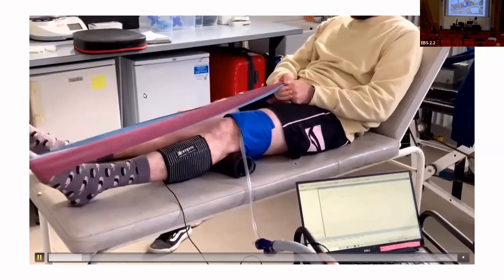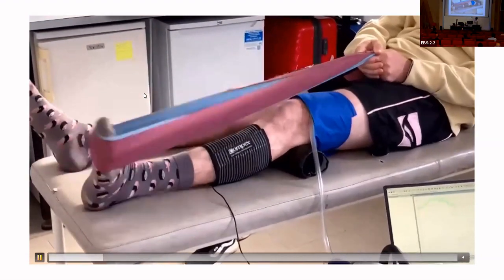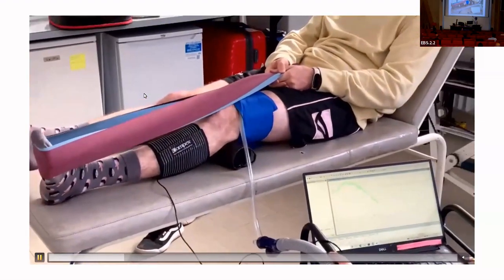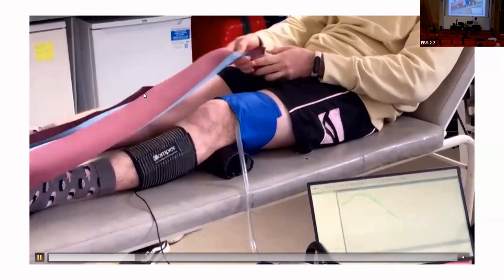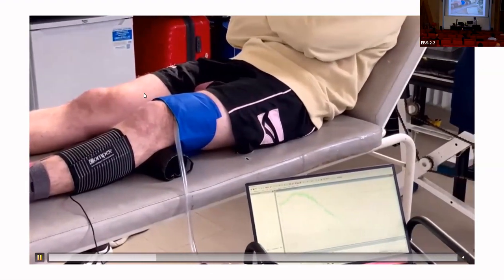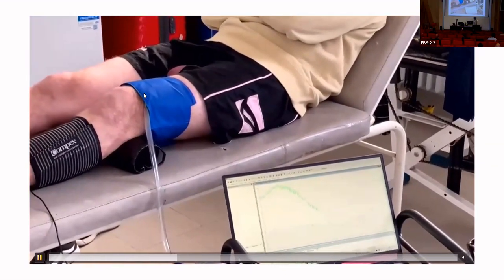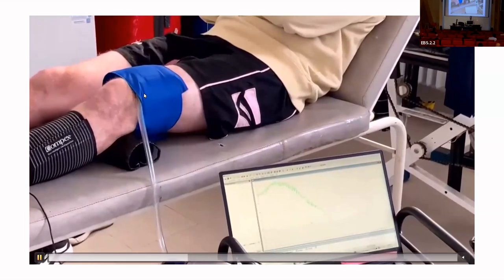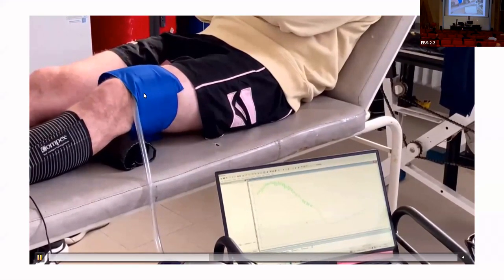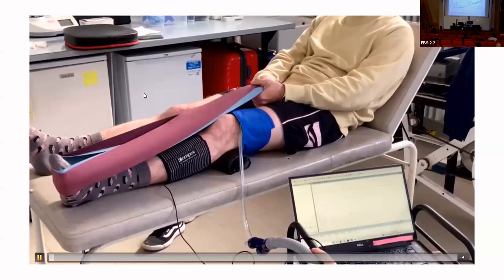So we usually ask the subject to perform an exercise. The near-infrared device is on the gastrocnemius, and here you have the pressure cuff that can be pumped up at different times. Unluckily it's not really easy to see, but you can measure the changes in the TSI signal during the cuff occlusion, and by that calculate the muscle oxygen consumption over time, so in the recovery from exercise.